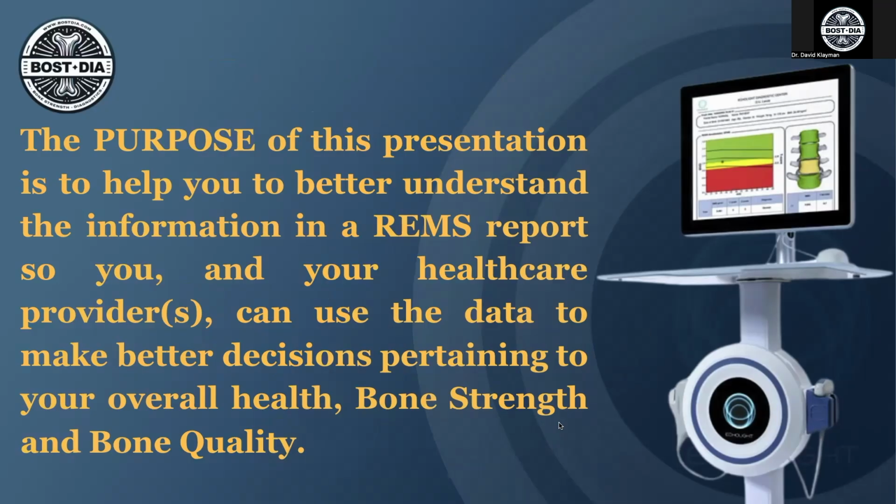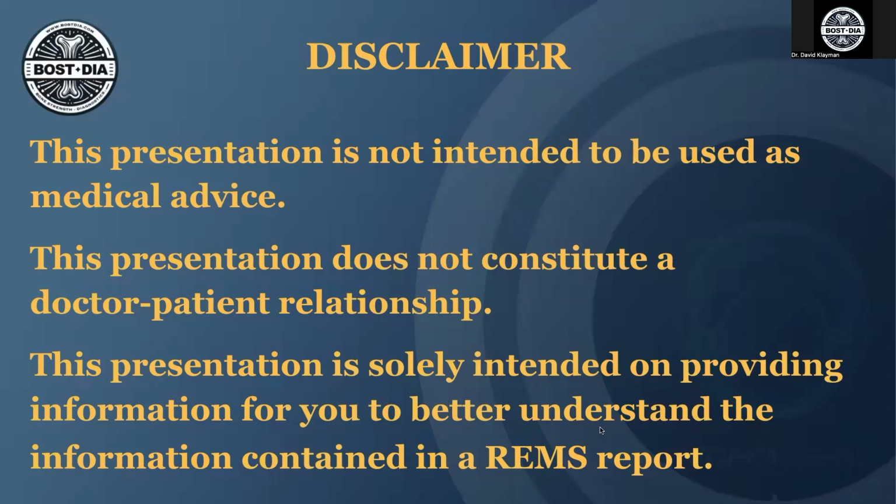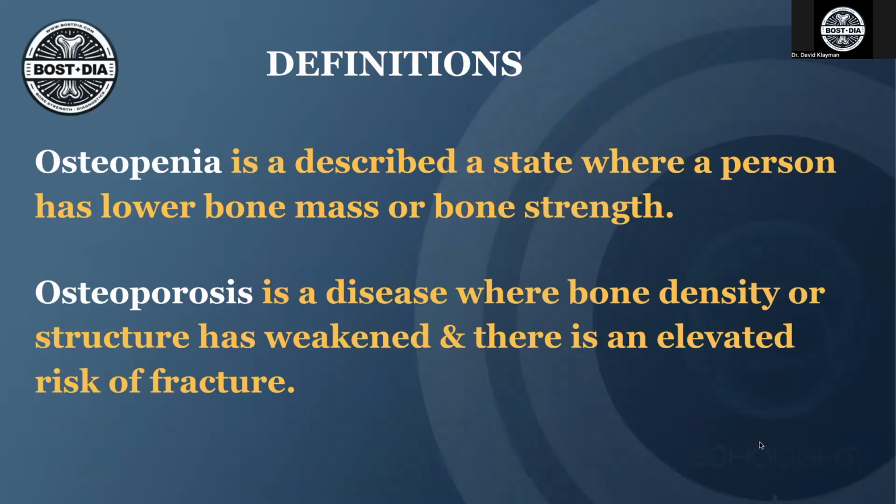The purpose of this presentation is to help you get a better understanding of the information contained in a REMS report so that you and your healthcare providers can use the data to make better decisions pertaining to your overall health, your longevity, your bone strength, and your bone quality. This presentation is not intended to be used as medical advice. This presentation does not constitute a doctor-patient relationship, and the presentation is solely intended on providing information for you to better understand the information contained in your REMS reports.